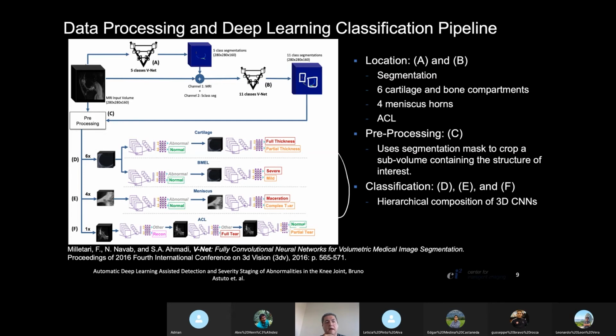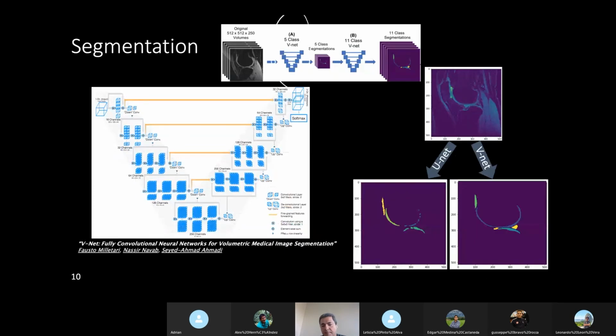We are trying to develop networks that do this kind of assessment without needing to do this localization, because this localization is prone to error. For example, here, when we are using the UNet, I can find the bounding box just fine.